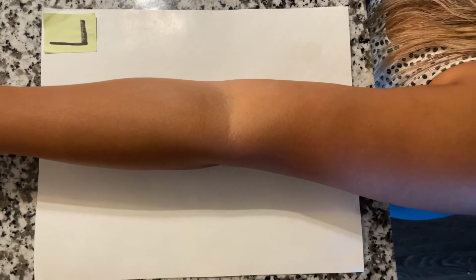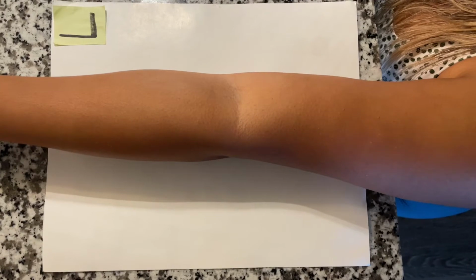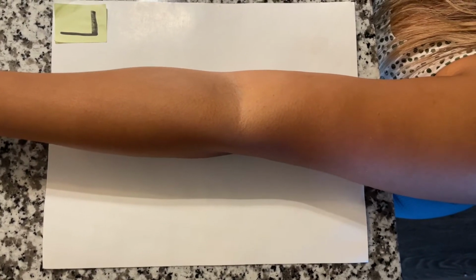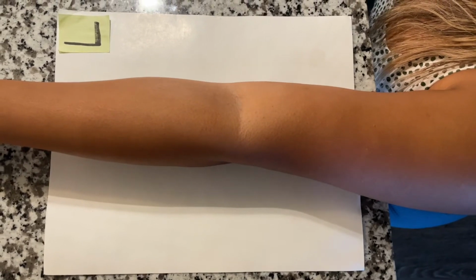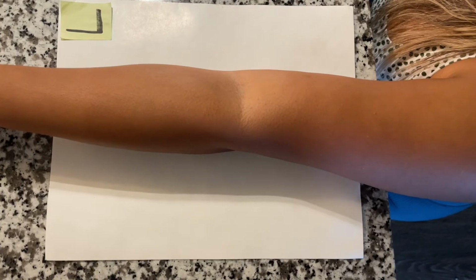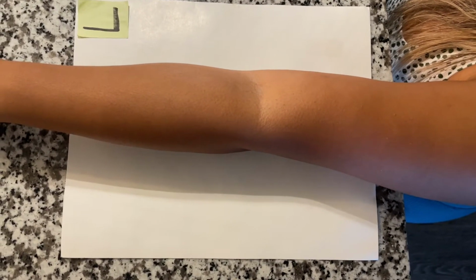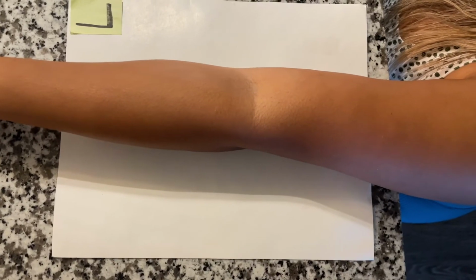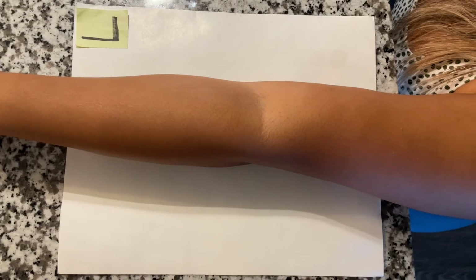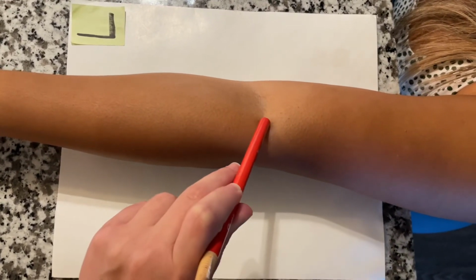For medial oblique elbow, internal, we'll start with the arm extended, palm supinated, and then pronate the hand. Then the center of the elbow joint is centered to the film. A line through the humeral epicondyles will form a 45-degree angle with the film plane. The center ray will be perpendicular to the center of the elbow joint through the center of the film space.